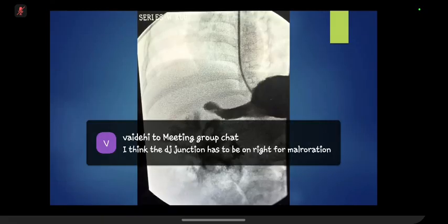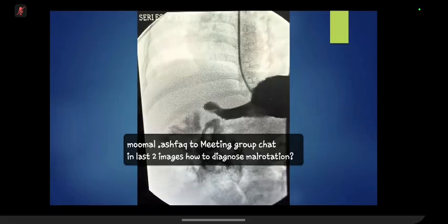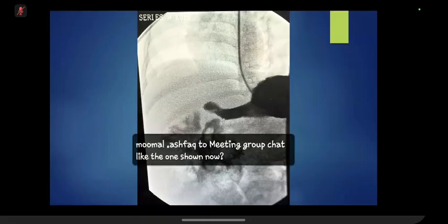Whenever you're confused or think there can be a possibility of intestinal non-rotation, first of all, the examiner will not show you a case of intestinal non-rotation on fluoroscopy, because they are less symptomatic, the patient might go into adult life and present with appendicitis later on, which might be missed because the appendicitis is usually not right-sided; in that case, it will be left-sided.